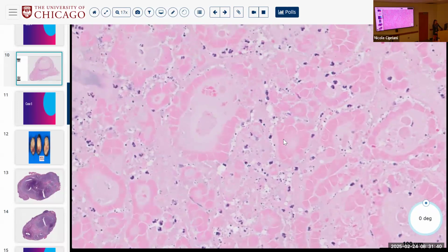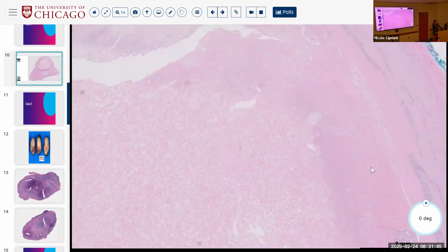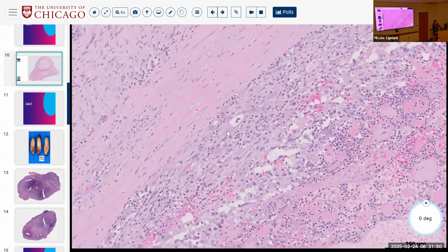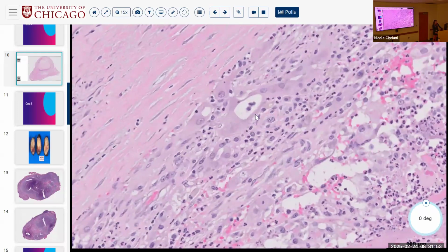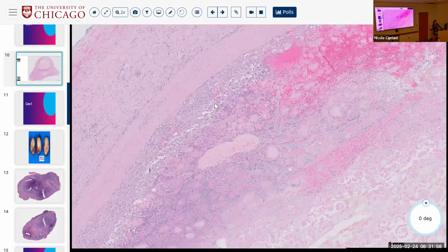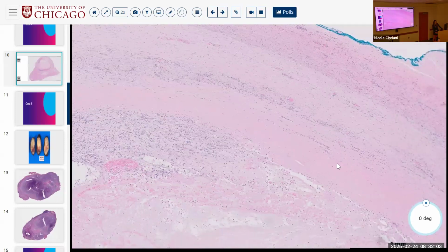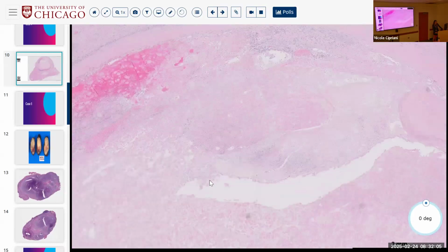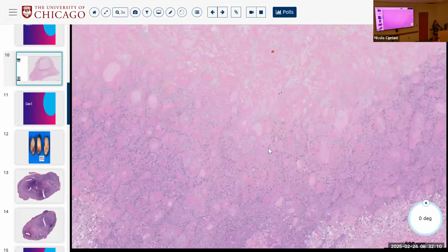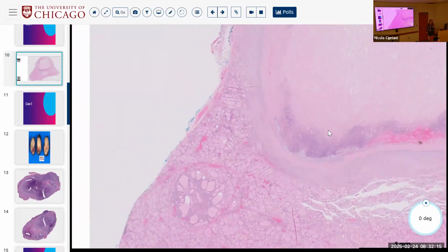So these are probably the residual cells, with questionable viable cells at the periphery, which some of them may or may not be actual epithelial cells, and many of them are probably histiocytes. But there is a relatively intact-ish capsule with a lot of desmoplasia and some fibrosis and some histiocytes like we saw, and maybe even some hematoidin, this really bright yellow stuff. So what happened to this nodule?